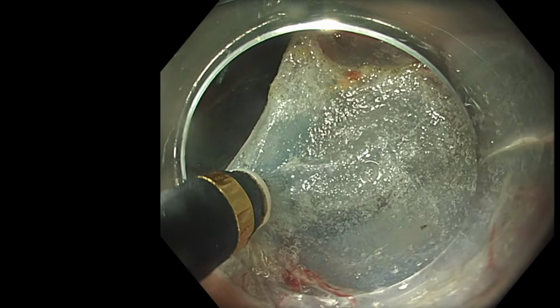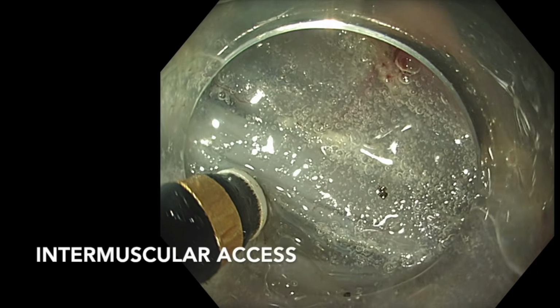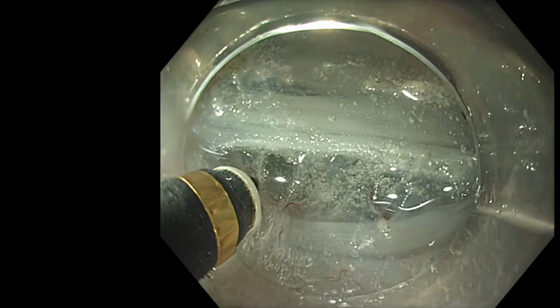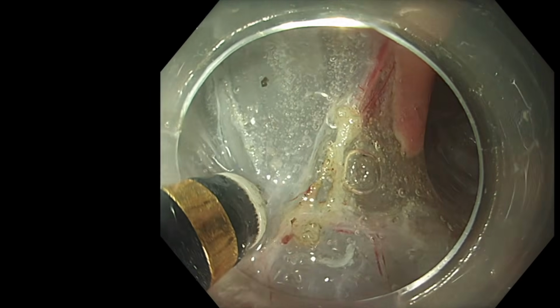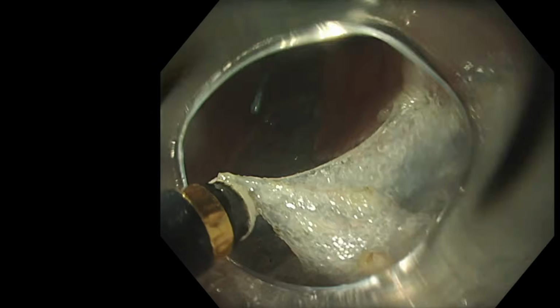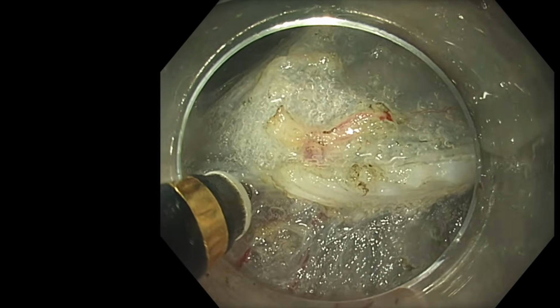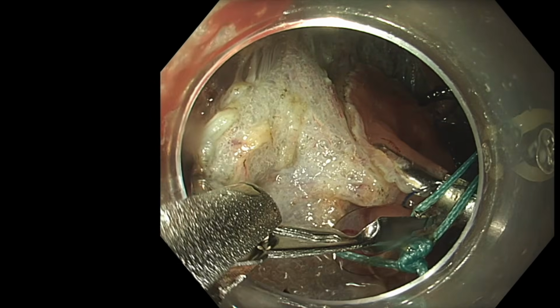So first you begin as an ESD, a submucosal dissection, but once you see clearly the circular layer, you will change your ESD into an intermuscular resection, injecting not the submucosal layer but the intermuscular layer in between the circular layer and the longitudinal layer, and your resection will be a deeper resection in order to be sure to obtain an R0 resection, even if there is a deep invasion submucosal T1 cancer.